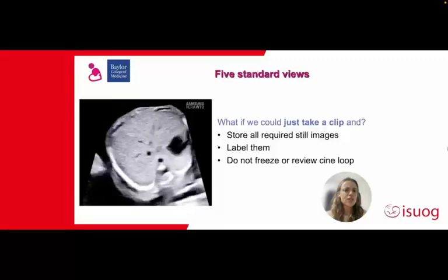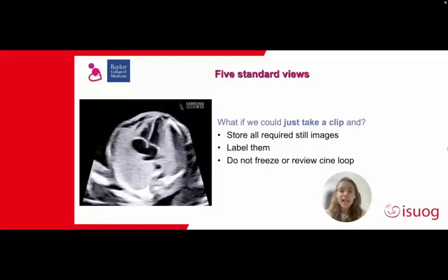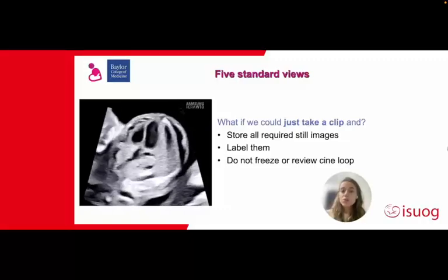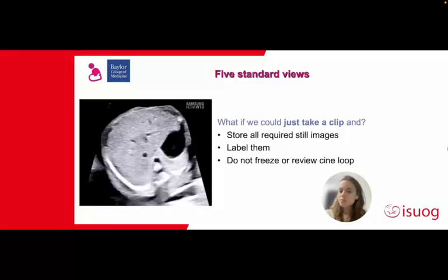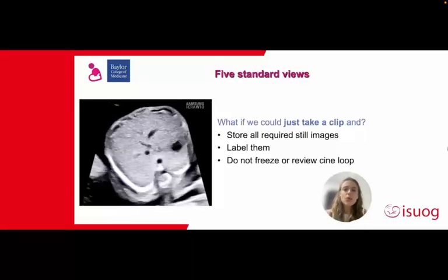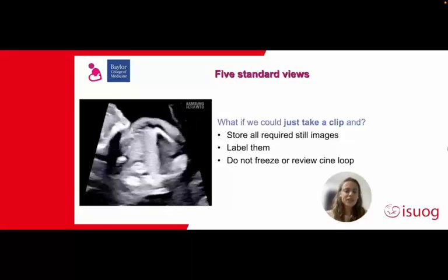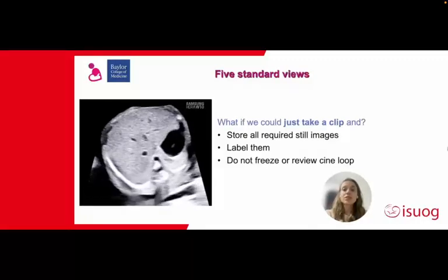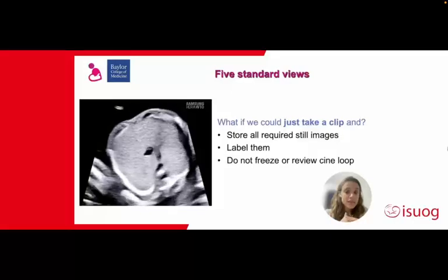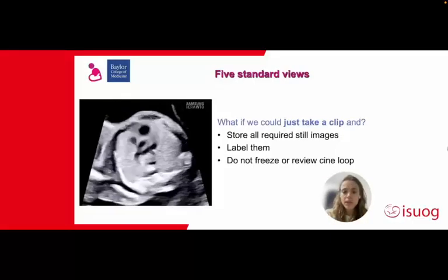So the question is, what if we could just take a clip, scan live, and then without stopping, without freezing, without going in a loop, back, forward, just automatically as the software is recognizing the different views and the different planes, it's storing the images as still images, not as a clip, the ones that we need to record, and even label them.